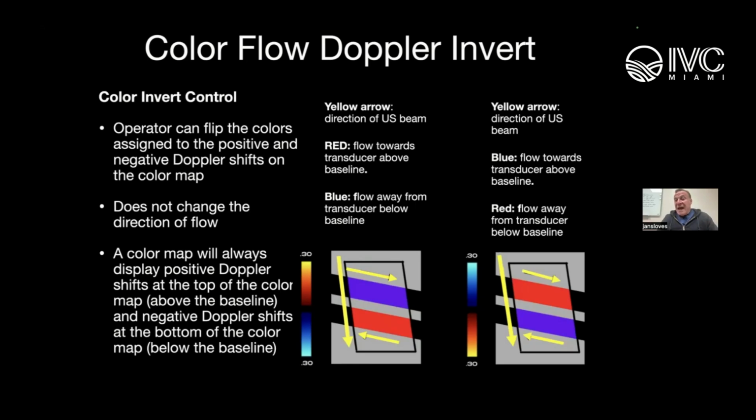We certainly see that. I do a lot of arterial work where all of a sudden you have loops and curves. You have situations where veins are very tortuous. So, this is not uncommon to see. And then you're going to have to invert and make these changes, to make sure that you are following the correct direction of flow that you're trying to assign.